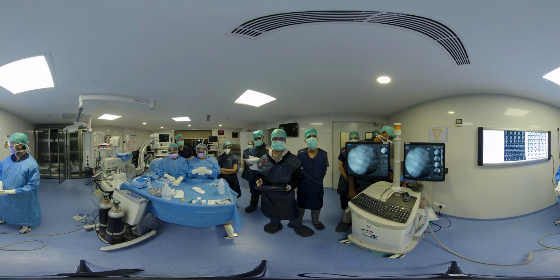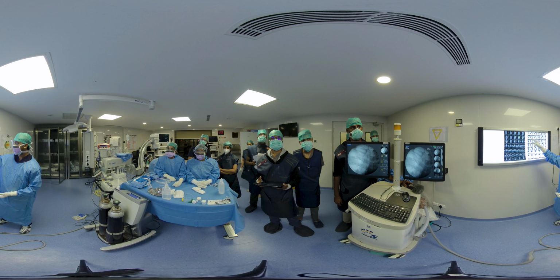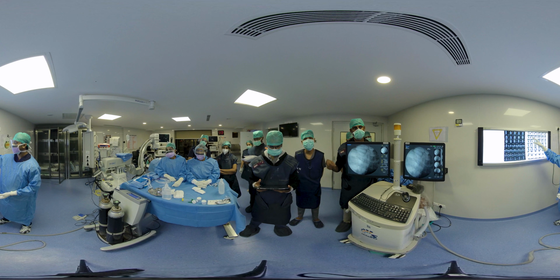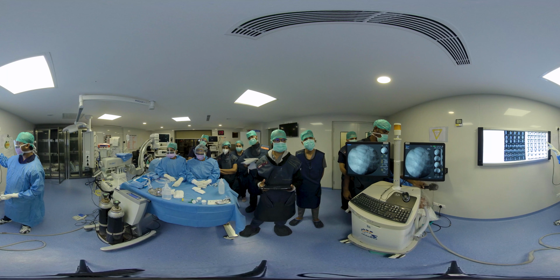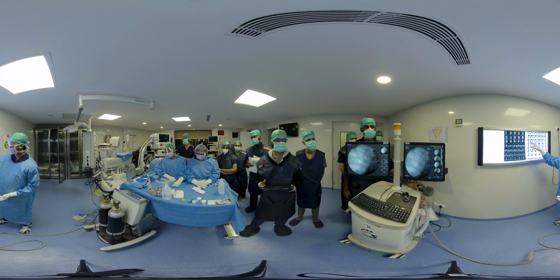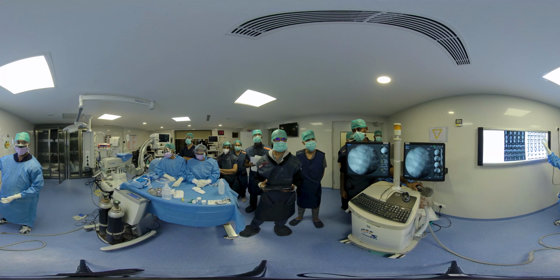Today we have this patient who is a 60-year-old male, and as you can see from the CT scan here, we are having a mass lesion in the posterior segment of the right upper lobe. He is a hepatitis B positive patient, so we are taking utmost precautions. And as you can see from here, there is a bronchus sign which leads into the tumor, so there is a very high possibility we will get a concentric image.